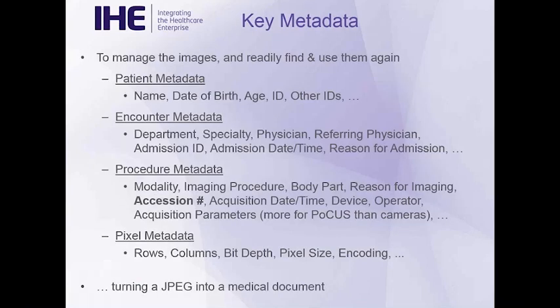And so this profile is really focused around marshaling that metadata, communicating, and getting it tied together with the images. So if you want to be able to manage those images, if you want to be able to find them and use them again, and if you're not going to find and use them again, what was the point in taking them in the first place and storing them?